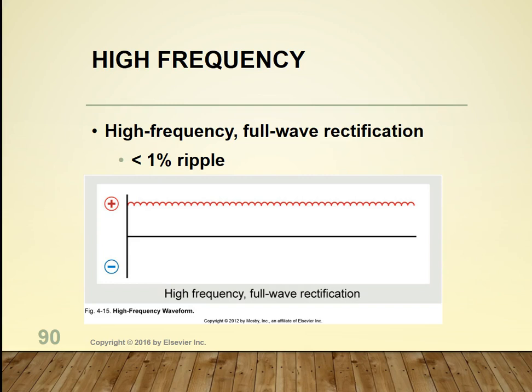And this low voltage high frequency is then passed through a step-up transformer that converts it to high voltage AC. It goes again through rectifiers, that's why we need all 4 of those, and it's moved to provide an almost constant potential voltage waveform. And these high frequency full wave rectifying generators produce an X-ray tube with less than 1% ripple.